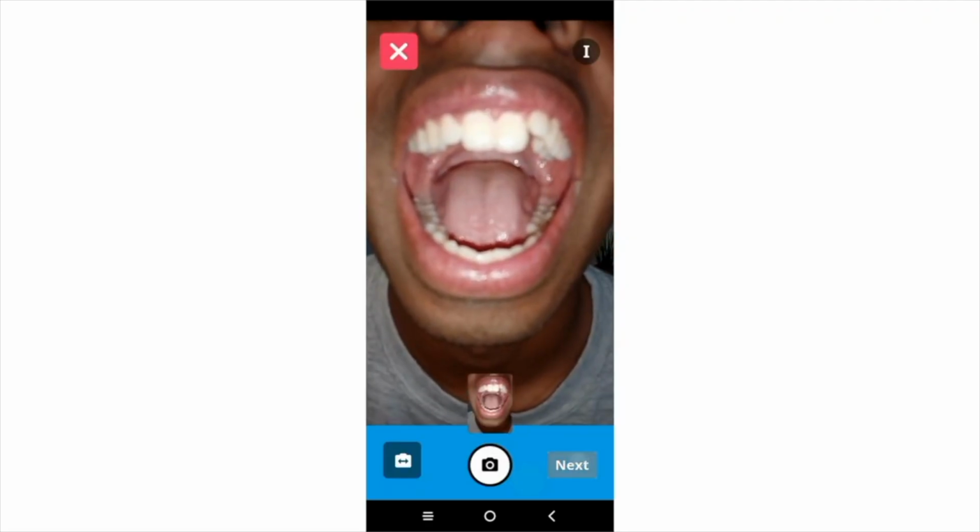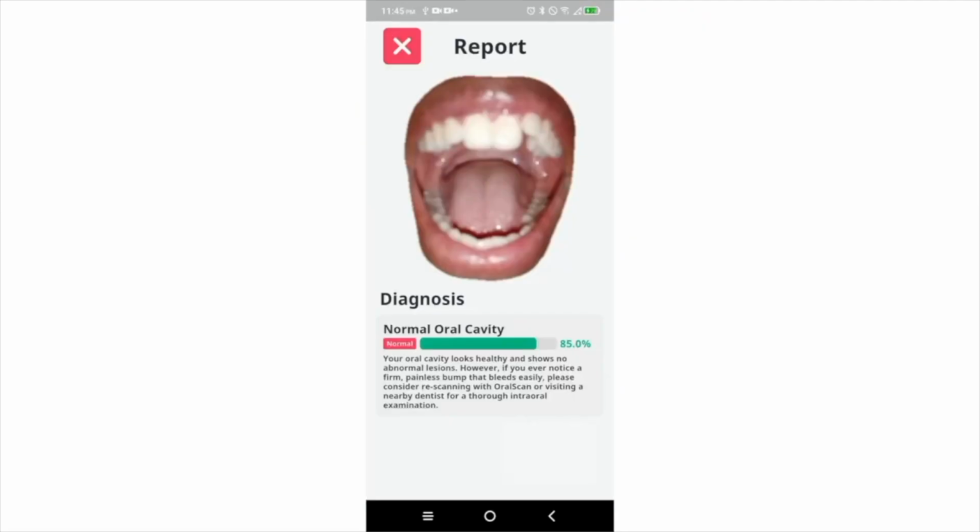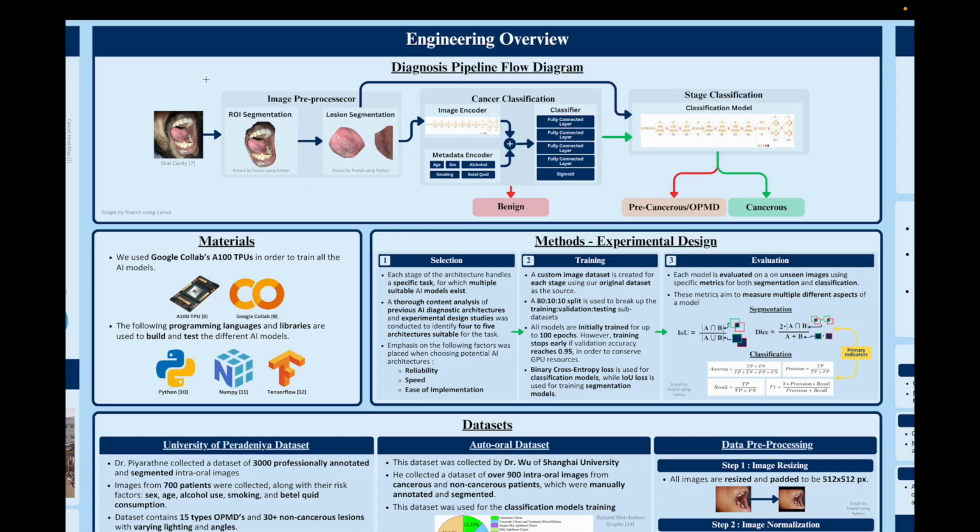To make a new diagnosis, patients simply take an image of the mouth, fill out the 5-question survey, and in under 15 seconds, they can see a detailed diagnosis regarding lesion location, type, severity, and future directions, getting a full oral cancer screening from the comfort of their home. So before we dive into the code base, here's a quick overview of how the models work.